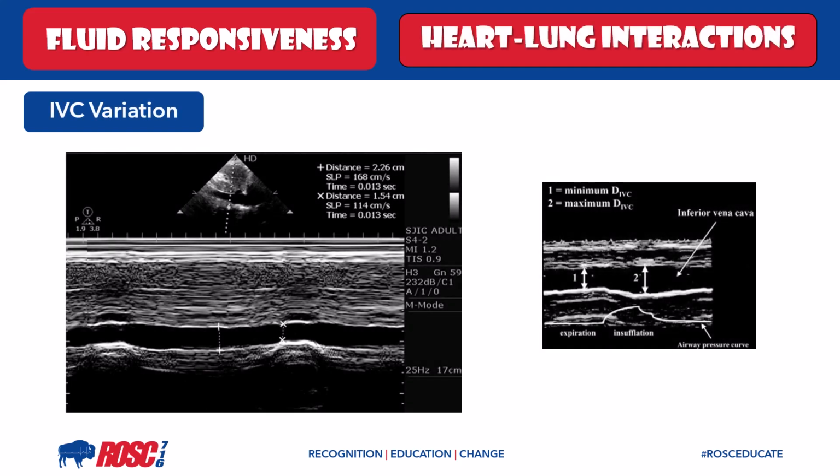So here's some examples of IVC measurements. As we know, we find the IVC in B mode, and then we switch to M mode. A simple explanation of M mode is a slice of ultrasound over time. First, we would freeze the image. And as we're returning to talking about dynamic measures, we're going to look at 2 different measurements of the IVC. We're going to look at one at end expiration and the other at end inspiration, and both of these are in mechanically ventilated patients.